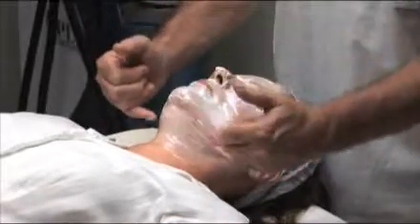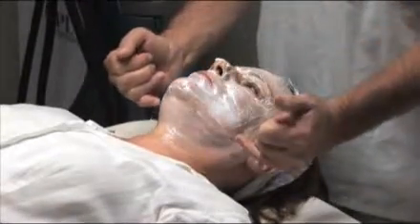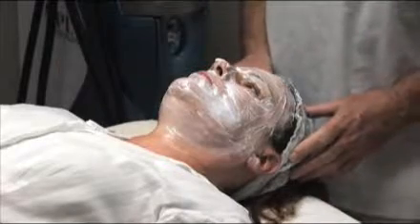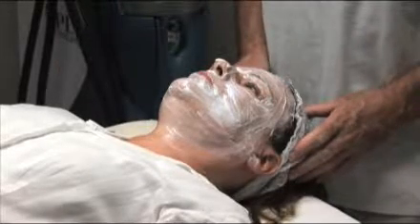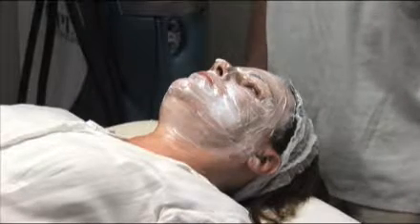We can also treat under the chin and the submaxillary area. This isn't possible with ultra-pulse CO2 lasers, for which we must limit the application to the bone edge. With this laser we can go beyond, there's no problem. We will let the anaesthetic cream take effect. This will take approximately 10 minutes.